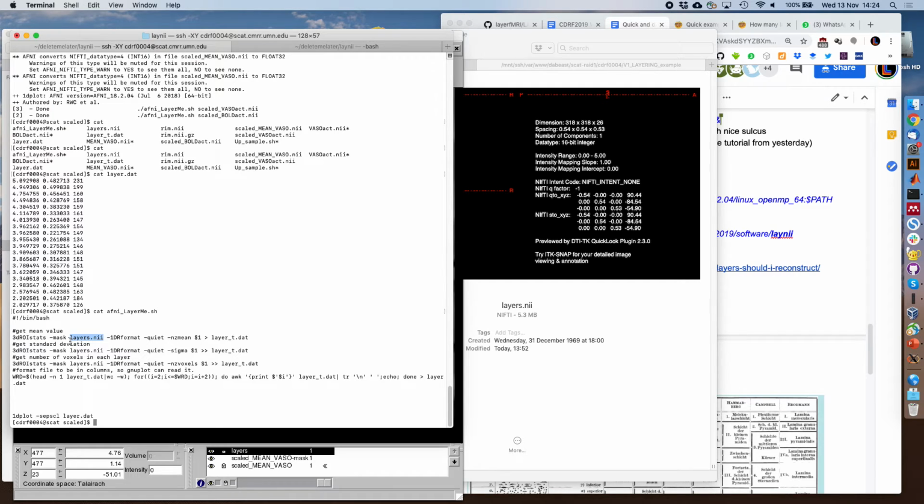I didn't find it so convenient, mostly because at that time our scanner hard drive was limited and your data becomes so huge. The export to your local machine, the motion correction, everything is slowed down so much. So I found it easier from a logistics perspective to upsample later.